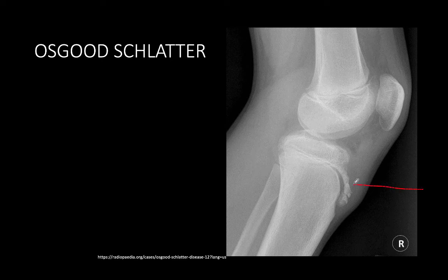So you'll notice here the tibial tuberosity, and that it almost looks like there's a widened space between the tuberosity and the parent tibia. And realistically, the synchondrosis, or the cartilage that sits between the tibial tuberosity and the tibia, is really an extension of the tibial growth plate. And one of the challenges is the hyaline cartilage attachment with the very strong pull of the quads. And you'll notice here there's some soft tissue swelling occurring. When making the diagnosis of Osgood-Schlatter, you need all the pieces to fit.